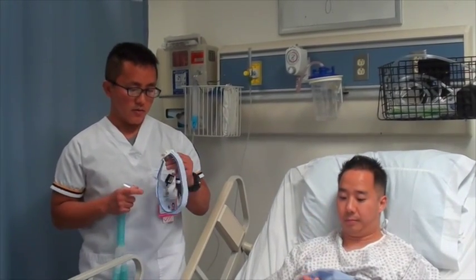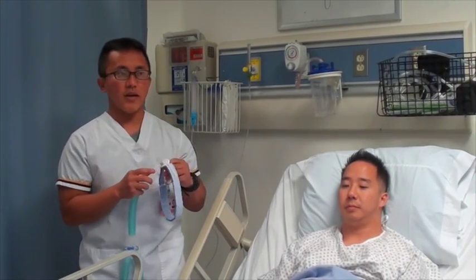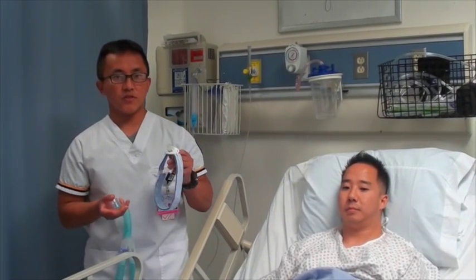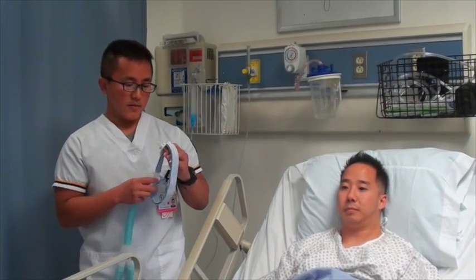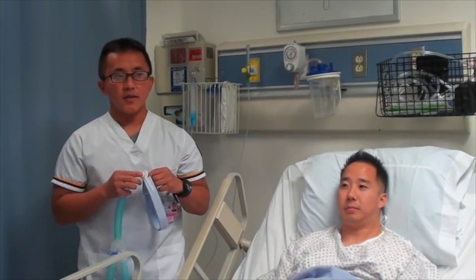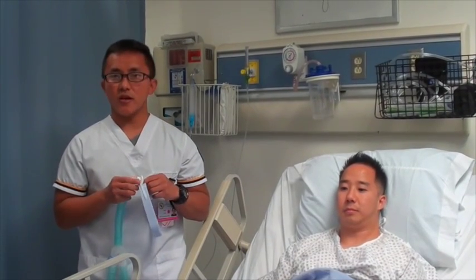Other things are that secretions can build up around the tube or the collar, so it has to be removed every 4 hours to be cleaned to prevent aspiration of fluid or infection. And condensation can and will occur in the tubing, so it must be drained distal to the tracheostomy tube.